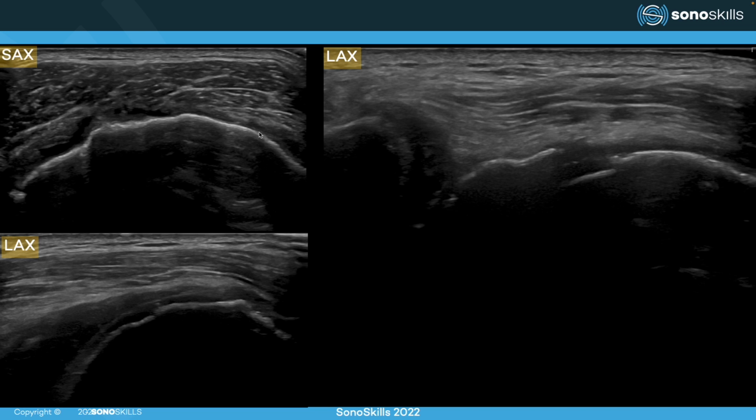And here we can see a full tear of the supraspinatus, totally retracted. This always leads to instability, always leading to a cranial migration of the humeral head. And what happens then is that during abduction, there is bone-to-bone contact, grinding of the bone and becoming erosive, the greater tubercle and also the humeral head. So in these patients where you don't see any cuff, you will see lots of erosion. And during this active abduction, we'll see, and you will hear, the grinding and you will see the erosion.